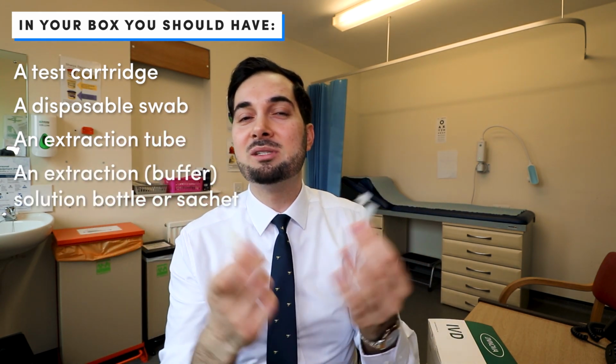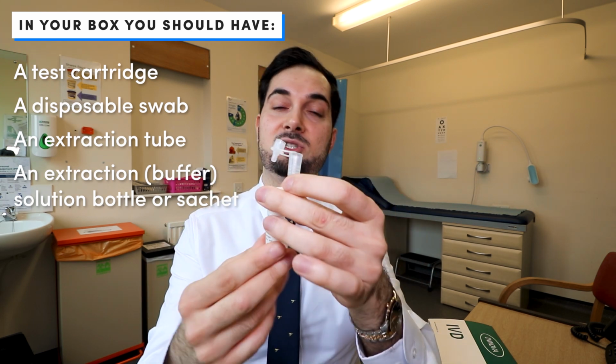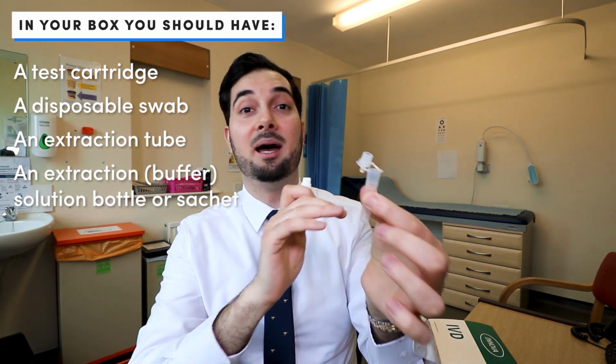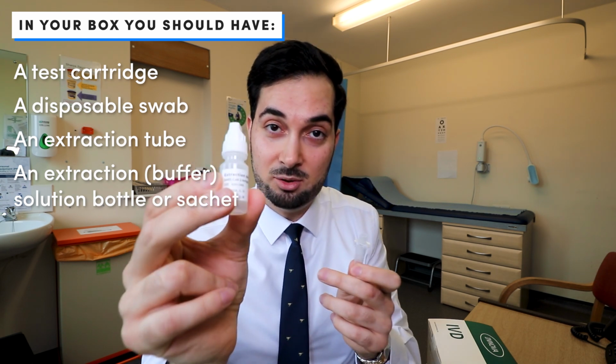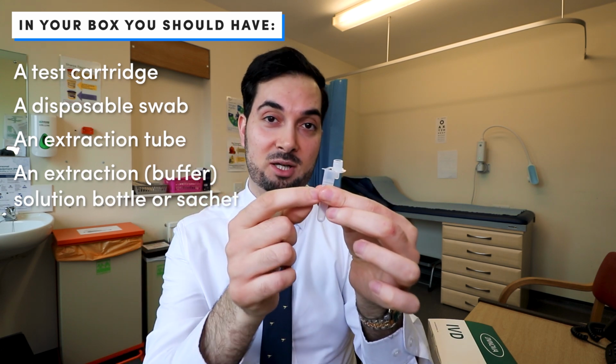This is the bit that varies between different testing kits. For example, the IVD one comes like this. So you've got all your extraction solution in there, and you put a certain amount of drops in there, and that's ready for testing. Other test kits come differently. So some of them, it comes as a sachet. So your extraction solution comes as a sachet. It's got a pre-measured amount in there that you pour within your extraction tube.